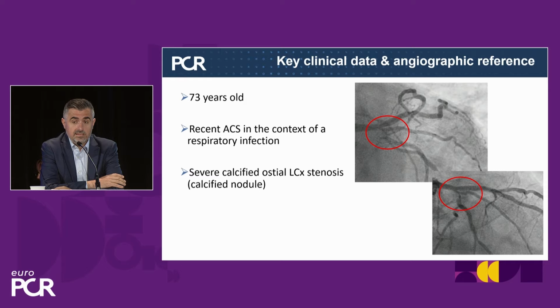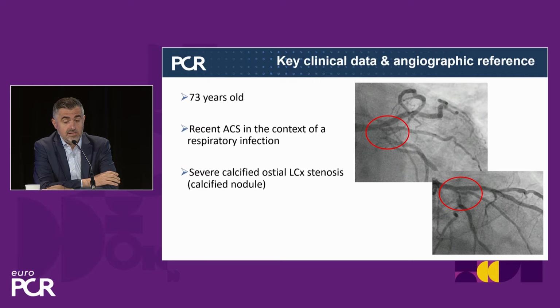I suspect that this is actually a left main problem, that we will end up treating the left main. And of course, having so much calcium in the ostial circumflex, and I'm sure we'll come back to that point later, is especially challenging. So this brings to my mind that in order to have more information, we need to image this.